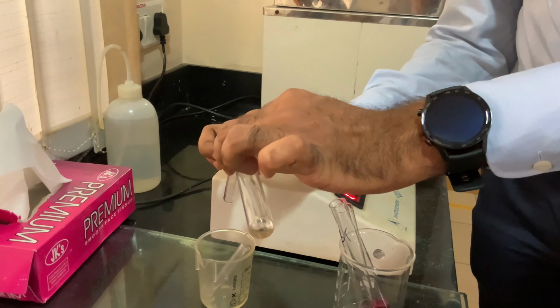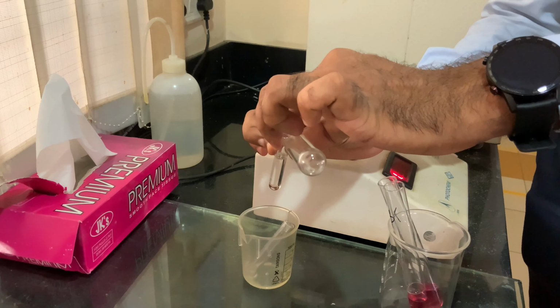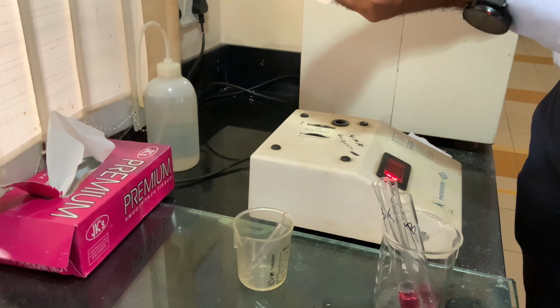The OD values measured of the blank, standard, and test solutions are noted down manually, and then they are used in a formula to calculate the concentration of the test solution.